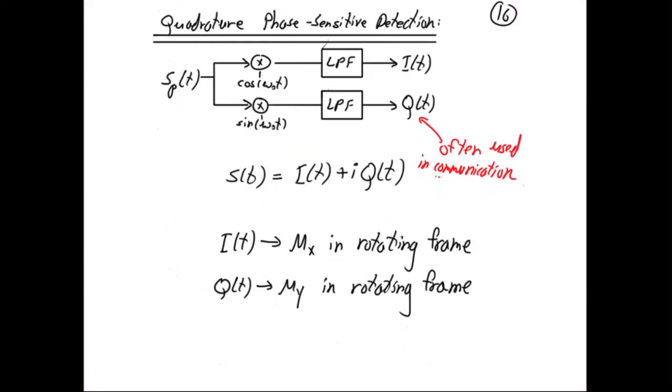You apply gradient, and that creates frequency versus space. Then you can decide where you want to center your slice if you modulate it. Okay, and are we doing that by changing the frequency of the RF signal we are applying? Yes, absolutely. The center frequency of the RF. Yes, this is how we do it. Okay, thank you.